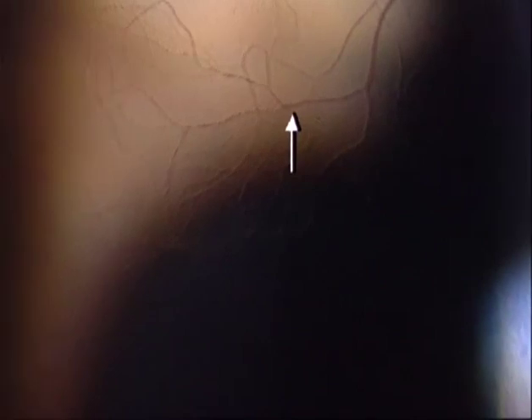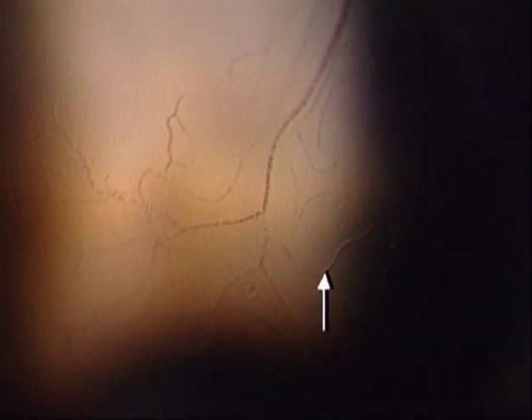Here the vessels are blurred by superficial scattered light. When the light beam is decentered, the vessels clearly appear by the absorption phenomenon of blood cells in the retroillumination from the iris, and even the movement of the cells can be seen. And here appear refraction phenomena caused at the surrounding vascular walls.